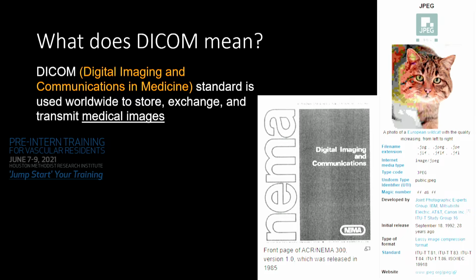All this information is buried, just like we go into our JPEG and go into the file information, it's all buried into that. And that is one of the reasons when we talk about anonymizing data sets for other research purposes, it's often very challenging because most of this information is built into the header files of these DICOM images. And this is what enables us to work on multiple vendor scanners. So you might have a Philips operating room where the patient might have a CT from a GE or a Siemens or a Toshiba scanner. What enables us is because we have a common standard.